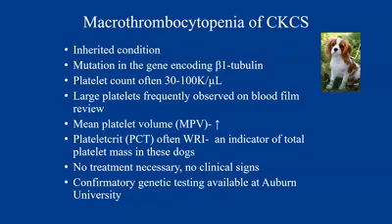And we can do confirmatory genetic testing. Auburn, Dr. Pete Christopherson, he's a platelet expert, he can do confirmatory genetic testing if it's the beta-1 tubulin mutation in these patients. It is not specific to Cavalier King Charles Spaniels, so other breeds can have it. This is just the poster child breed that we think about. And I think the last two cases point to the fact that we can get really important diagnostic information from the blood film that the analyzer can't tell us.